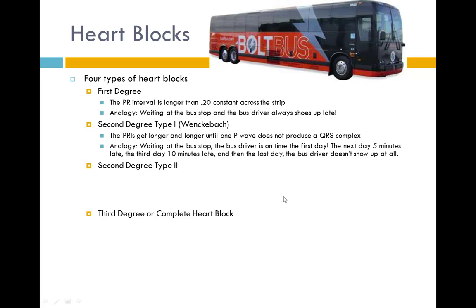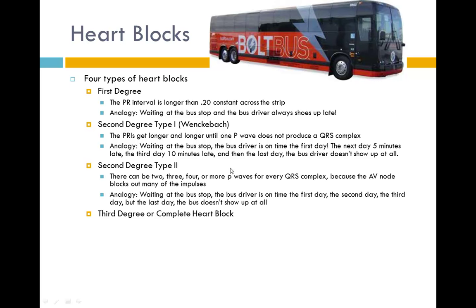So this analogy, again, back at the bus stop: the first day the bus driver's on time, yay! The second day the bus driver's 5 minutes late, oh no, and the third day the bus driver is 10 minutes late. You're really mad about this. And then the last day of the week, the bus driver just doesn't show up at all. So that's that dropped QRS complex. Again, second degree type 1, sorry.